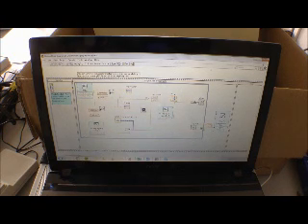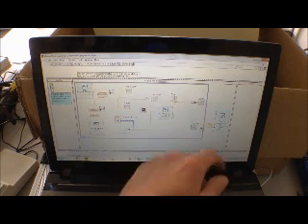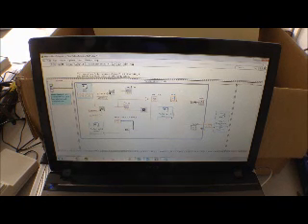This is all then contained within a loop, so it can run continuously until obviously told to stop, which is down in the bottom corner, and once that's done, everything's written into a measurement file, which in this case will be an Excel file, and therefore graphs can be then plotted and information can be analysed, and it can be then saved into a file, so you can then have a record of who's been tested, etc. So which is obviously useful in the clinical environment.